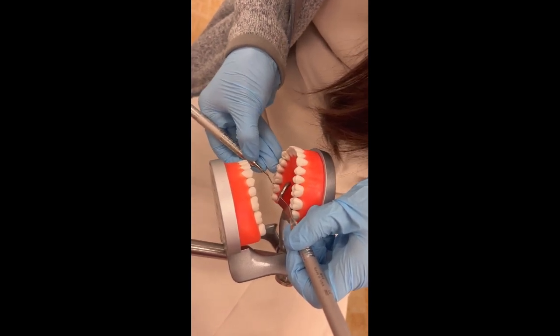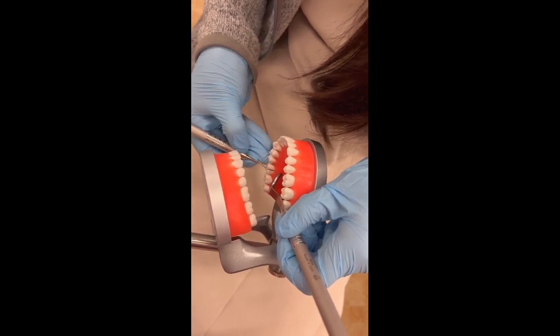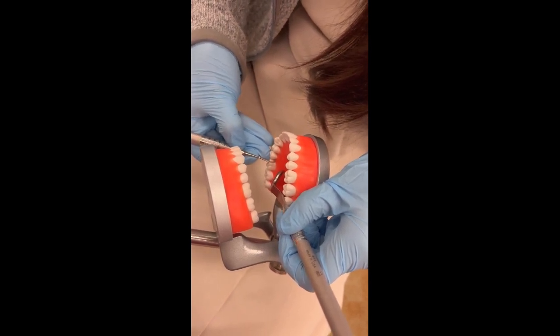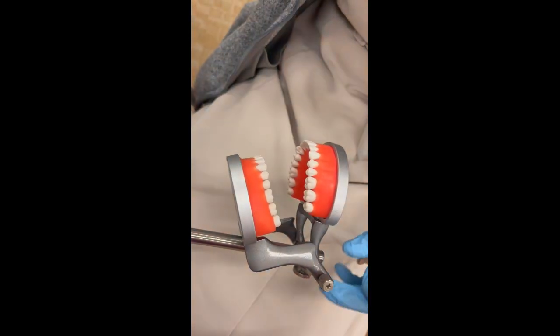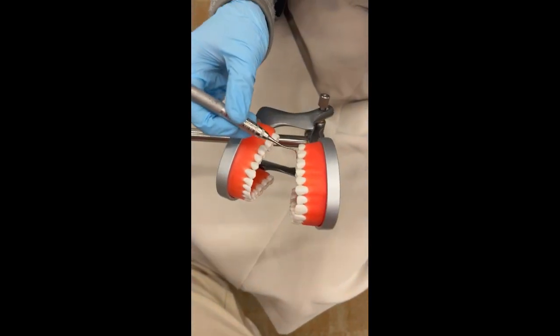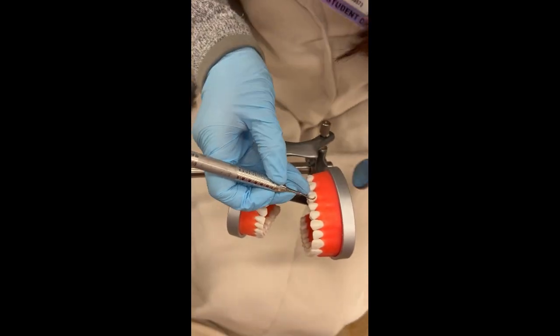The blade is correctly adapted when the toe is directed interproximally and the terminal shank is parallel to the tooth. To remove deposits, the cutting edge is applied to the tooth surface, and the facial surface of the blade is tilted towards the tooth to achieve a 70 to 85 degree angle between the tooth and the blade. Apply lateral pressures against the tooth and pull upwards while maintaining contact with the tooth.